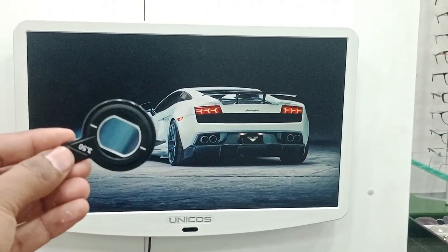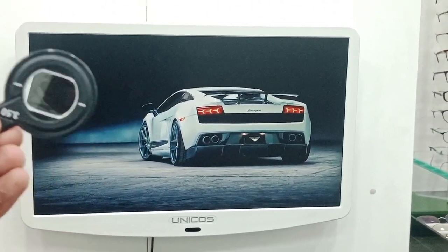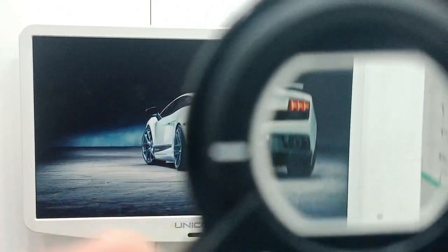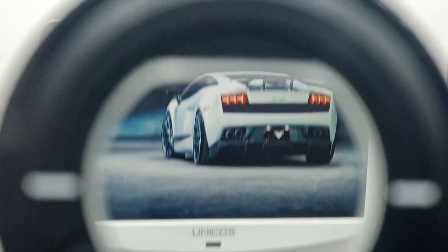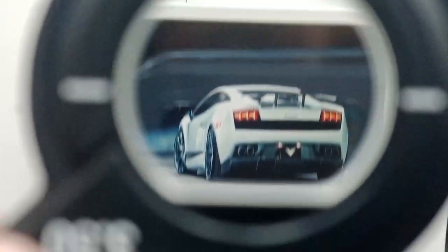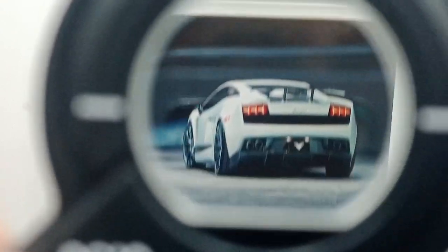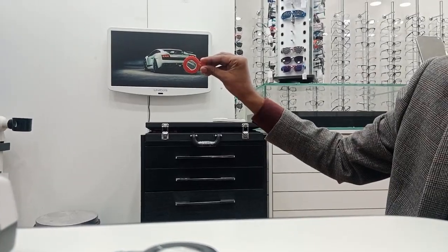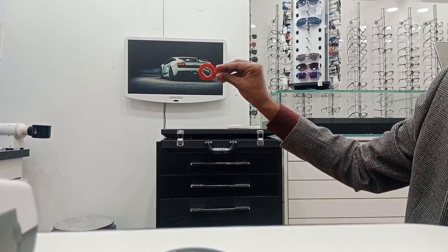Now for the plus cylindrical lens — since it is plus, there should be against movement, and as you can see the car and the lens are moving in opposite directions. Now I will rotate the lens, and as I rotate it, the car rotates in the same way. This rotation behavior confirms it is a cylindrical lens.